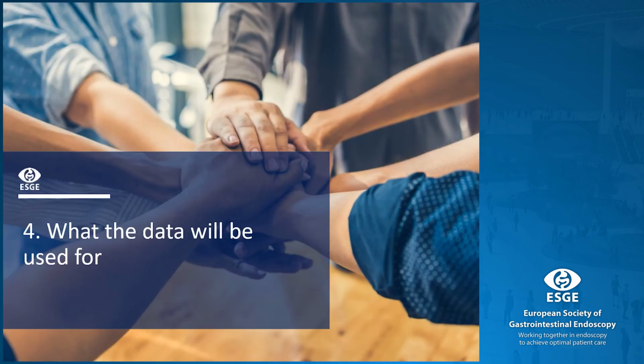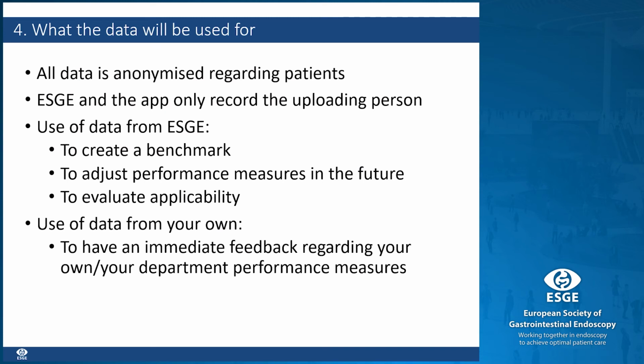What the data will be used for. All data is anonymized regarding patients. ESGE and the app will only keep a record of the uploading person of each case. How will ESGE use the anonymized data? ESGE will create a benchmark to see the true picture of quality, allowing to adjust performance measures and standards in the future, and also to evaluate its applicability.